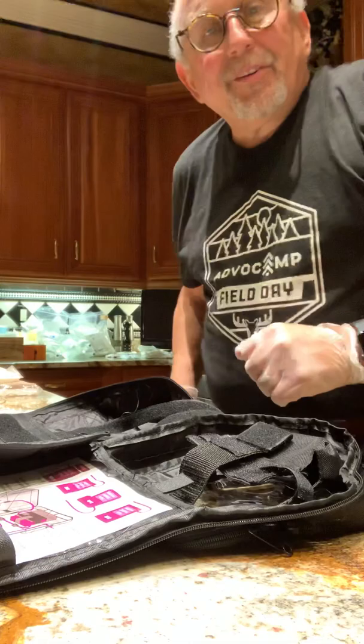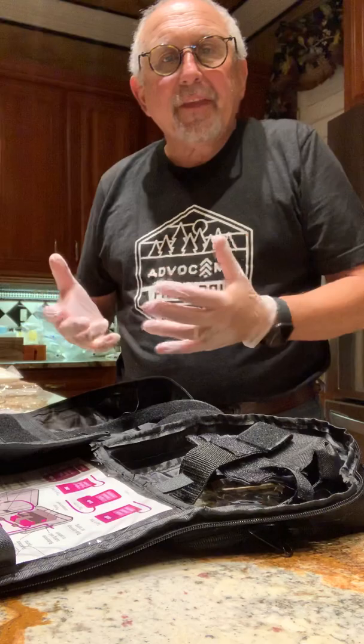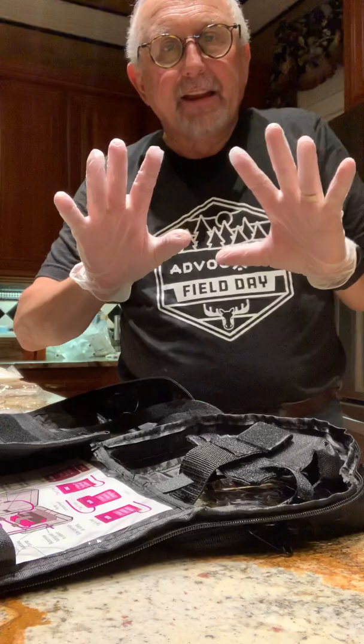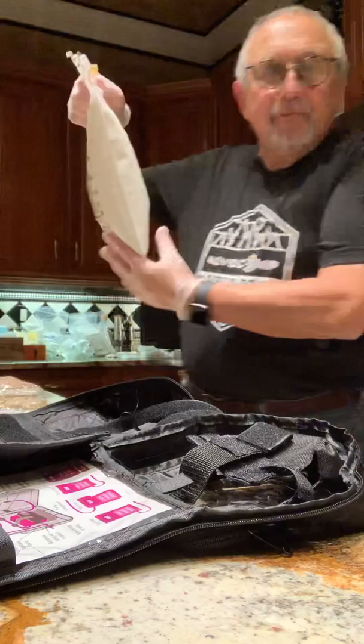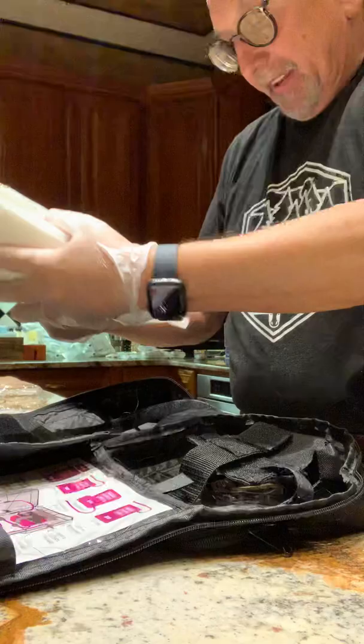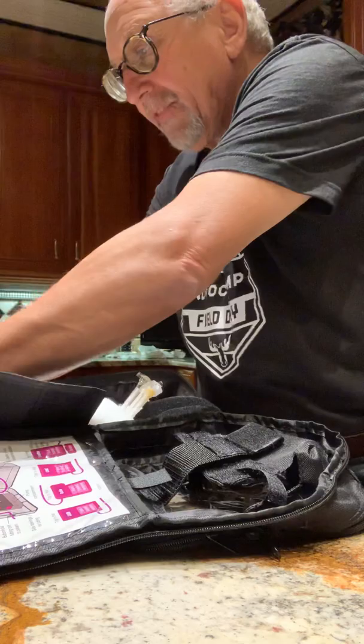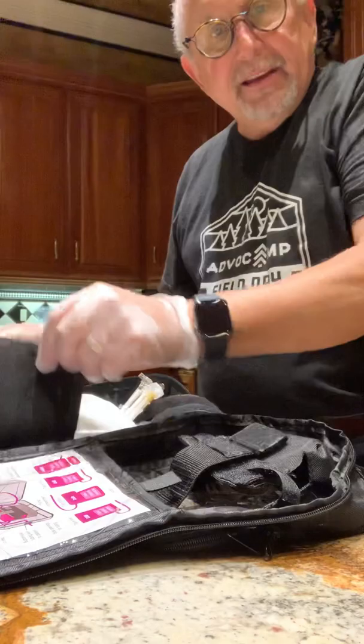Hi everybody, good afternoon or good evening. My name is Howard Tarnoff and I'm going to demonstrate how we put together TPN feeding for my wife Wanda. I've already sanitized my hands completely, put on rubber gloves, and taken the TPN formula — 2,000cc's specifically mixed to my wife's requirements — and I'm placing this into the backpack, which is a self-contained unit that allows one to maneuver around while bringing the nutrition with you.